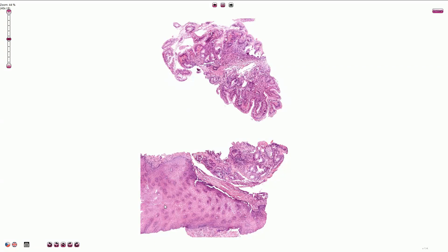Barrett's esophagus is a term used to describe the metaplasia of the distal squamous mucosa of the esophagus into specialized intestinalized columnar epithelium with goblet cells. It is commonly associated with chronic gastroesophageal reflux disease.